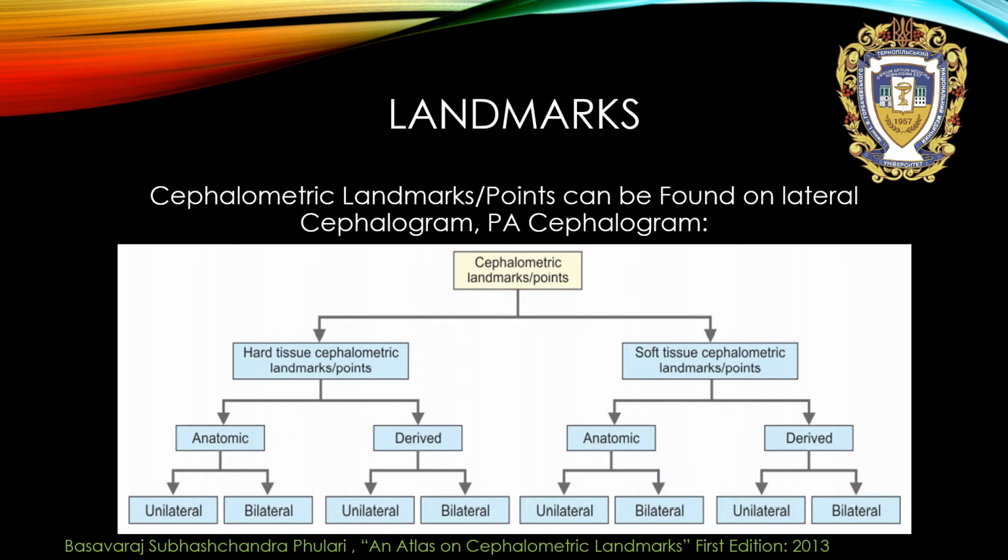And here is shown a full scheme of classification of cephalometric landmarks and points.